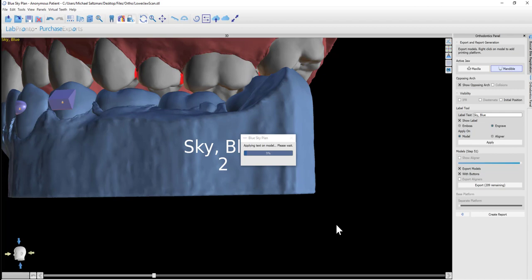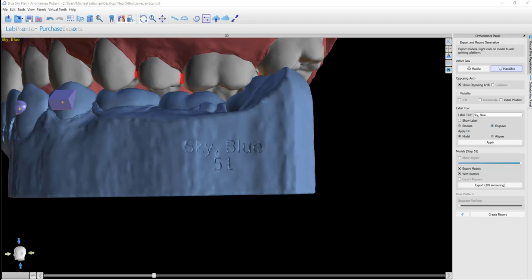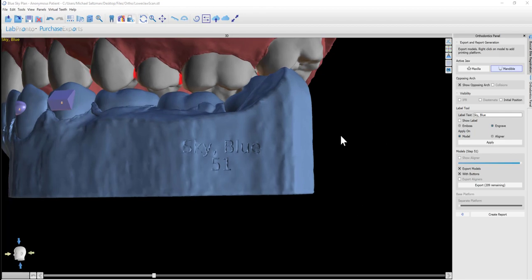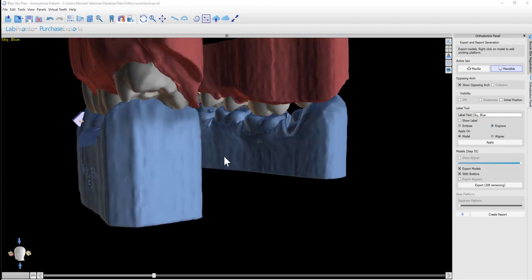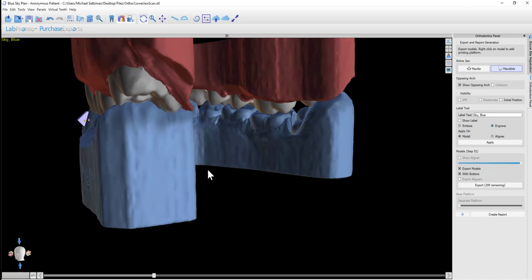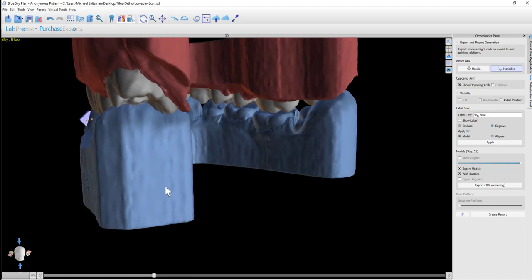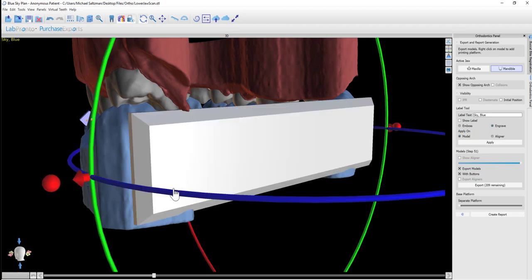Now the software is going to go model by model and automatically apply the text and the numbering, as we see happening on the screen. Once that's completed, the second thing we want to do is to add a base for vertical printing. This will allow us to print the models standing up on the print bed, printing more models in a single print run.